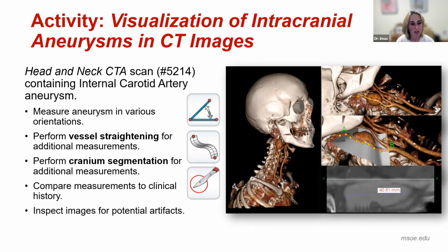So here, we talk a lot about bone segmentation in our class. And so here the students get to practice it and they get to really see how it works and see what happens to the blood vessels. Are they in there? Are they intact? And it really becomes a problem when you're trying to remove the bone at the base of the skull.